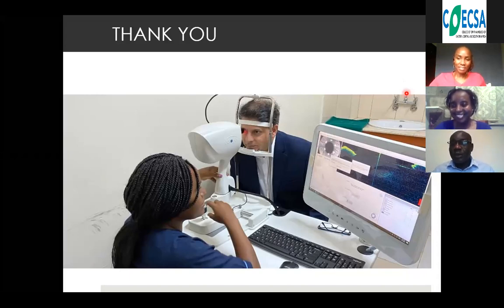I like the way you have explained some of the concepts very easily, like the concept of the ganglion cell complex, the red disease, the green disease. And I like the way you've tried to explain how the structure and function should be related. It's really necessary as doctors to know that what you're seeing on the OCT is really affecting the patient, that it really changes the function of the eyes. I hope one day there will be a machine that will have both the structure and function.